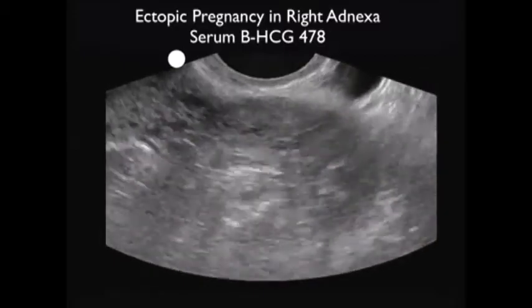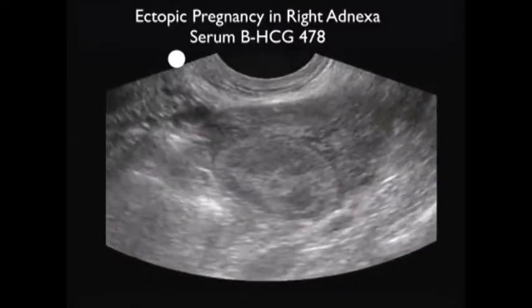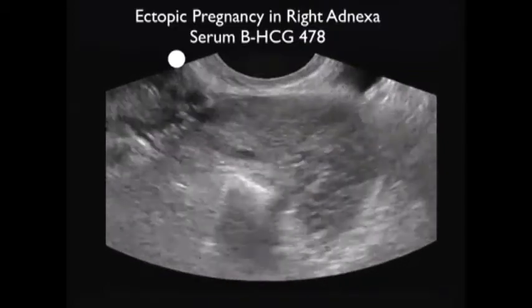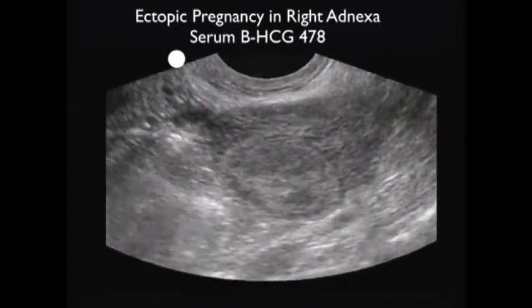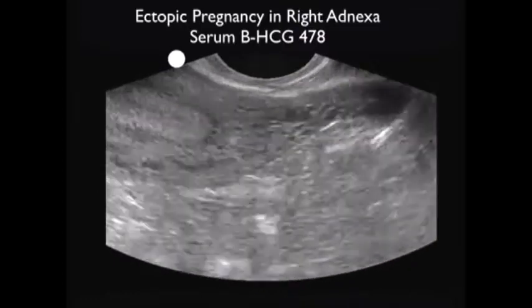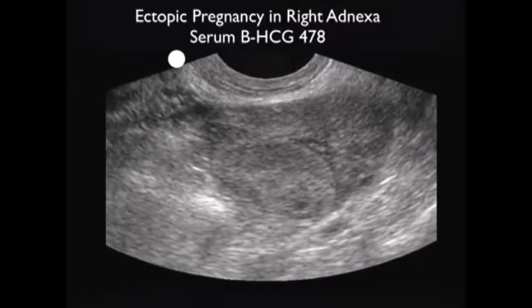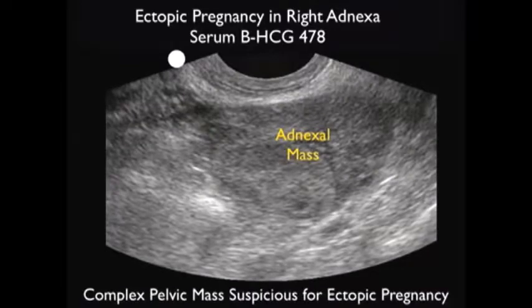Here's another ectopic pregnancy, and I'm scanning out from the midline uterus, as seen there, out towards the right adnexa. And notice there what we see is another complex pelvic mass out towards the right adnexa. Next we're going to still that image down, and it almost looks like an egg-like appearance of a structure inferiorly within the adnexal mass. Very suspicious again for an ectopic pregnancy.